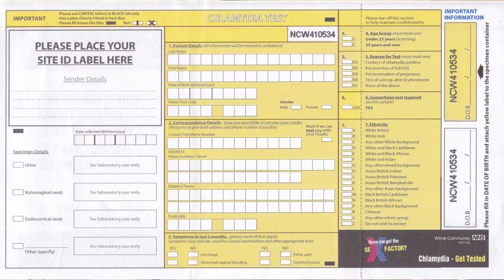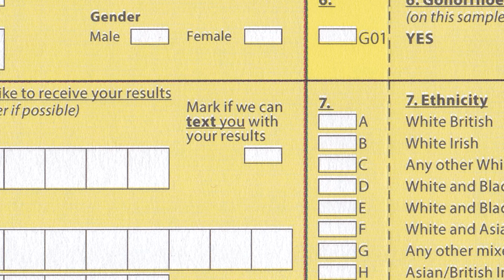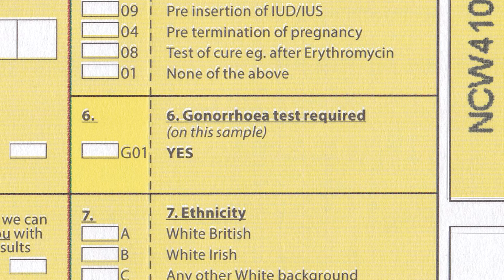Now inside, you'll need to fill some of this form in. So if you date it here and then tick which one you've had, fill in your last name, your first name, your date of birth, your postcode, tick whether you're male or female, your phone number, and then there's a box next to the phone number which says that we can text you your results. We need you to tick that, otherwise we can't text the results. There's also a box for the gonorrhea, saying gonorrhea required. Tick that box because, like I said before, both tests are done with one sample.